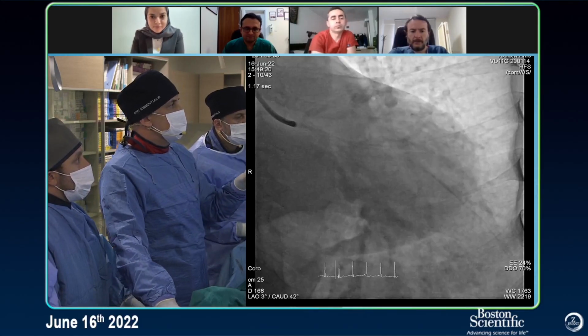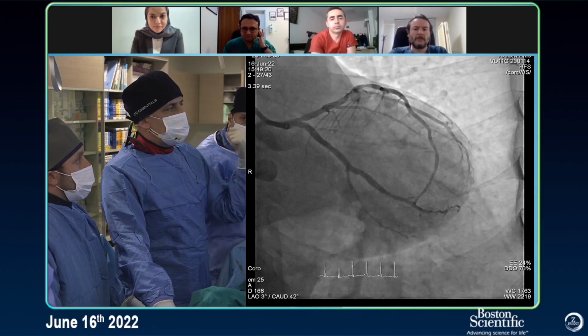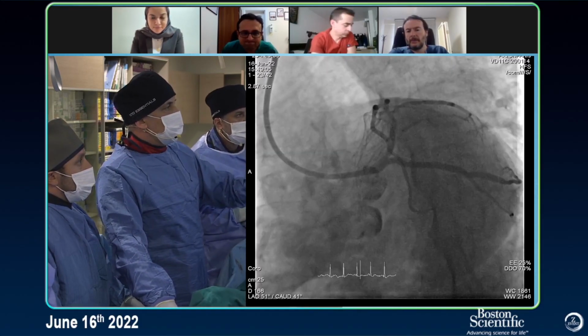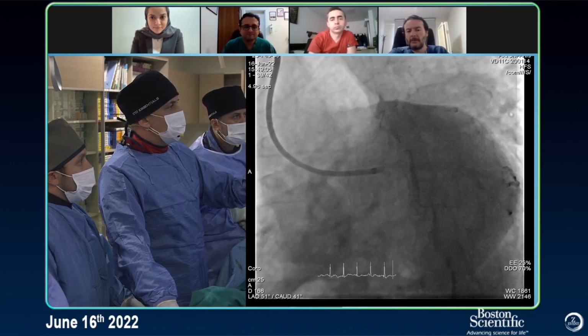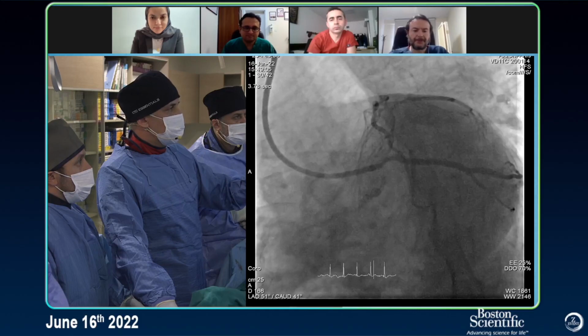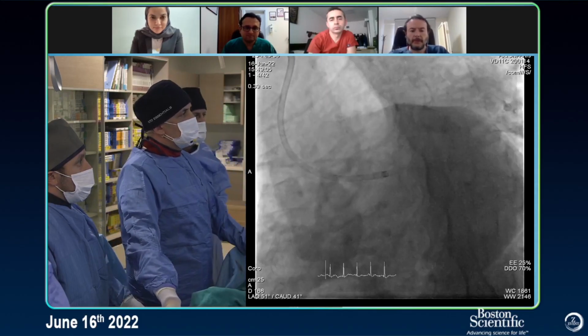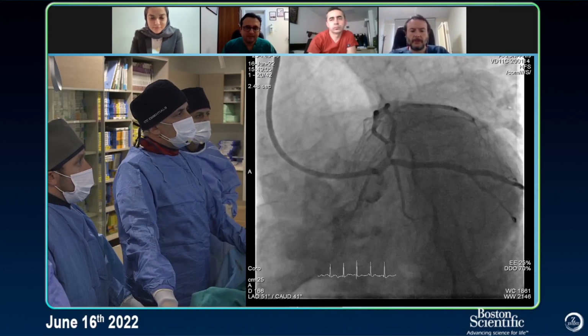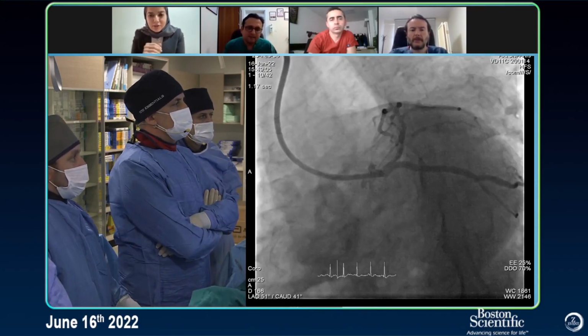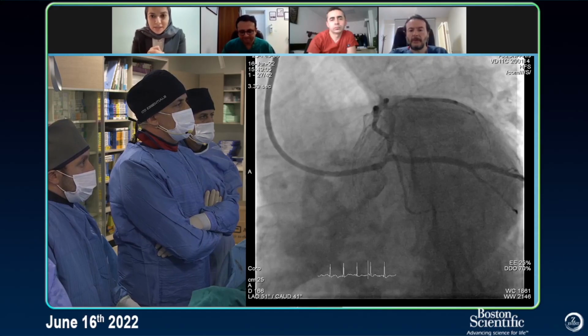by angio. This is spider view. Can you come back to the previous one? Spider view, please? Yes, here. What do you think for the ostium of the LAD? It looks definitely calcified, but also there is moderate stenosis at the ostium of the LAD. Do you agree with me in that position? Yeah, I agree. We'll go around too before you jump into the case.